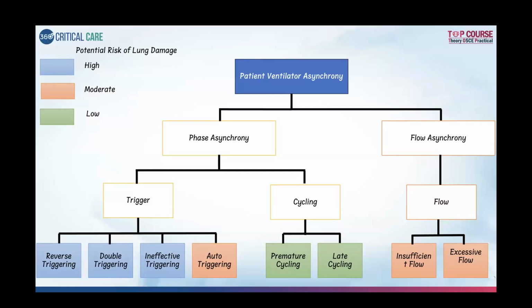mechanics or respiratory waveforms. Each of them is important. You need to identify, first of all, what causes it and how you take care of it. These are the three things they will be asking. The few other things that can be asked in ventilator or respiratory waveforms is auto PEEP. You guys are masters in auto PEEP, I believe, how to look at it and how to treat it. But that is another very commonly asked question: how to treat auto PEEP and how do you identify auto PEEP.